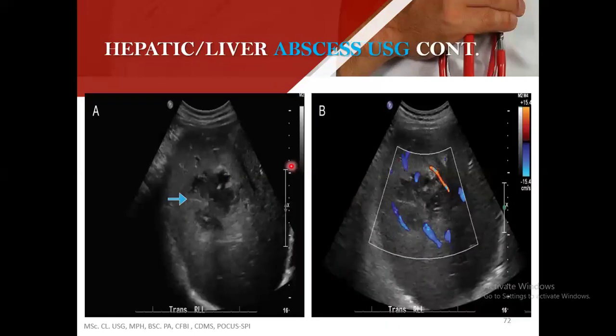And it is painful. Abscesses are painful. Don't forget it. There's another abscess. Have you seen Doppler is on it? But the Doppler didn't show flow inside. You can see the inside, there is no flow there. But outside, you can see strips of flow.